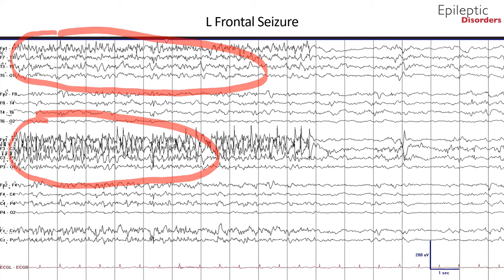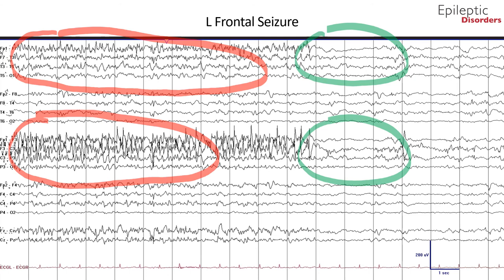Note the abrupt end of the seizure outlined halfway through the page, with post-ictal slowing that is greatest in the left frontal region, outlined in green. This seizure had evolution in morphology with initial poorly formed sharp waves to more narrow spikier-looking sharp wave complexes, evolution in frequency from 1 cycle per second to 7 to 9 cycles per second, and spatiotemporal evolution with initial left frontal involvement and subsequent spread to adjacent left hemispheric and midline channels.